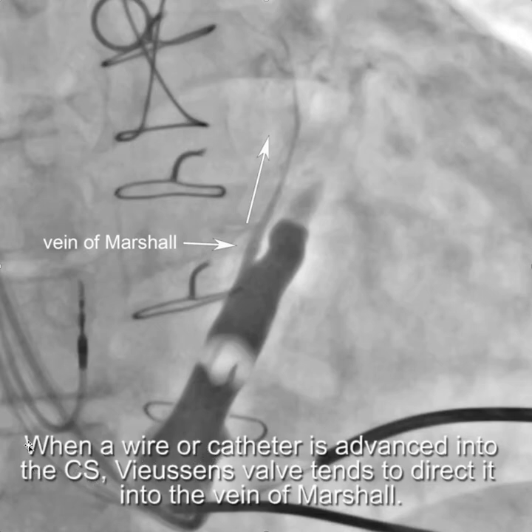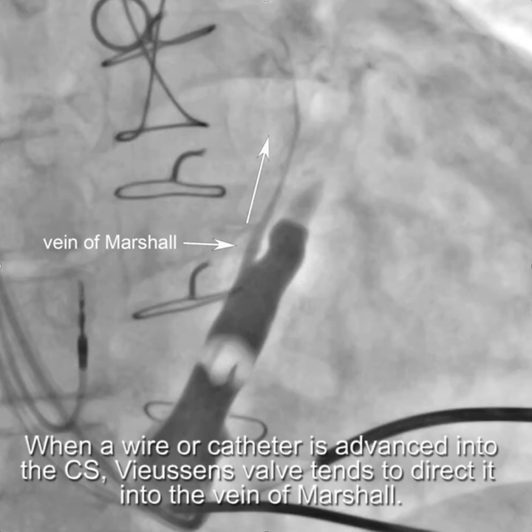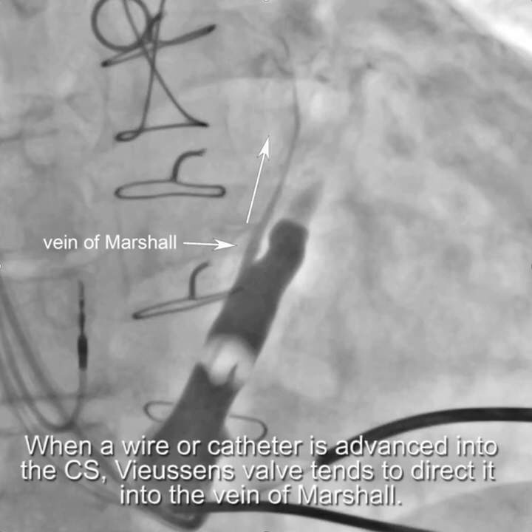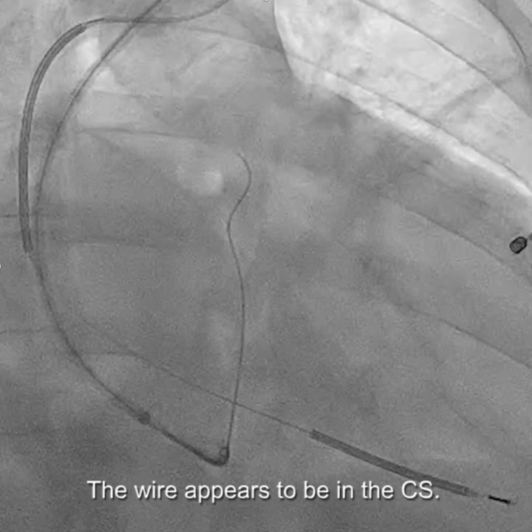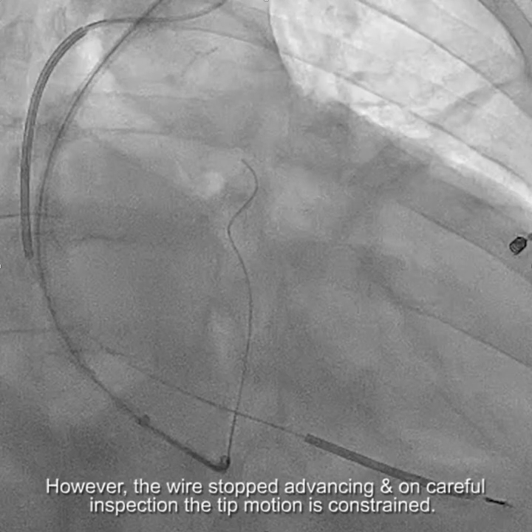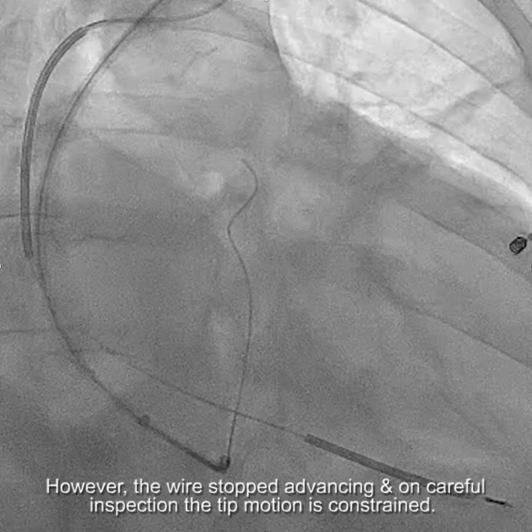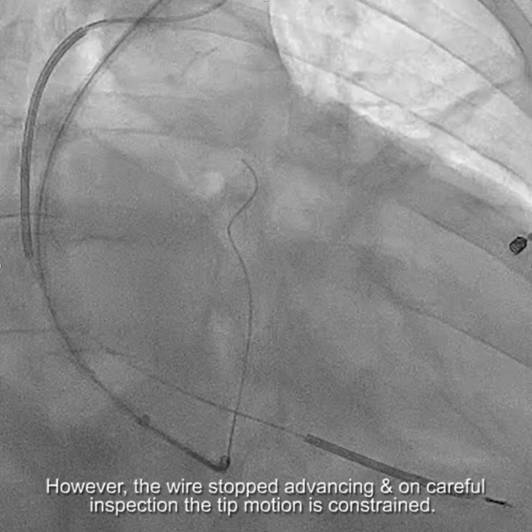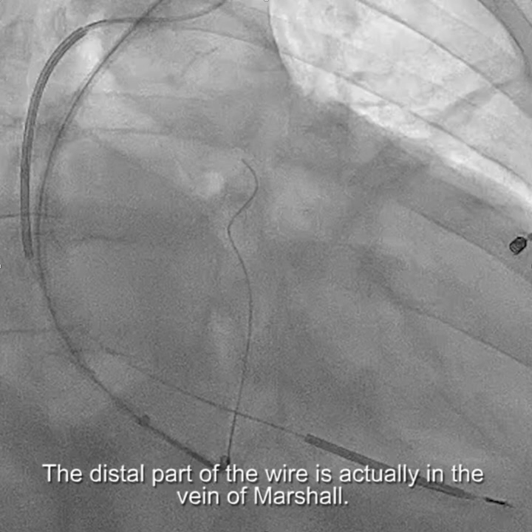When a wire or catheter is advanced into the CS, Vusensian's valve tends to direct that wire or EP catheter into the vein of Marshall. Here you see we're advancing a wire during CS cannulation — watch the way the wire advances and stops and sort of buckles up, which is a clue that it's not quite where you thought it was: it's in the vein of Marshall, not in the body of the CS.